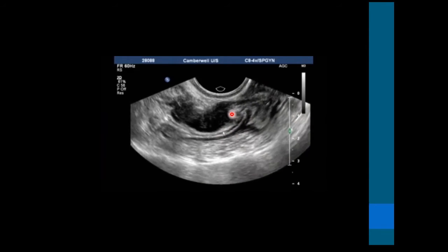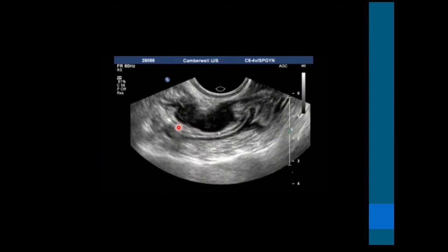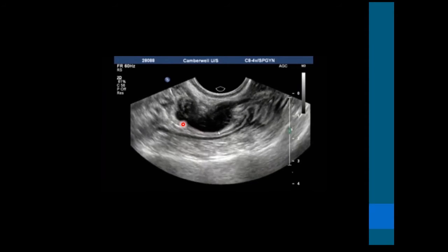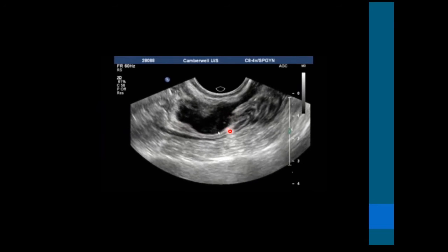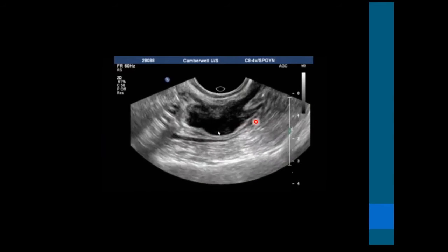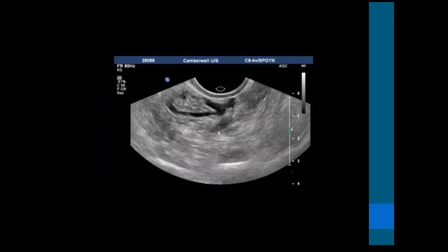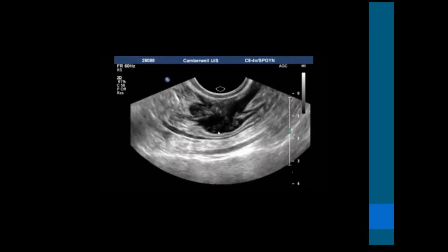That's endometriosis trying to infiltrate, and sometimes you see that everywhere. You see infiltration. They call that Indian headdress, and it's like all little black stripes going through the submucosa. Sometimes it's very subtle, and it's certainly not always easy to see, particularly if there is a lot of bowel gas.